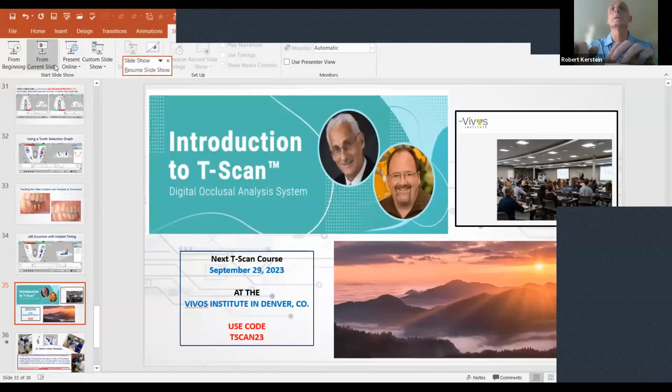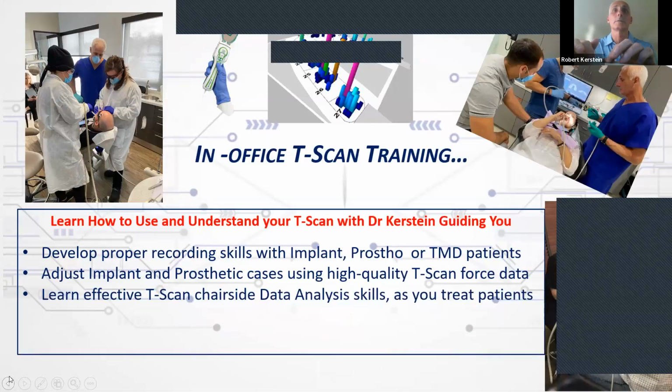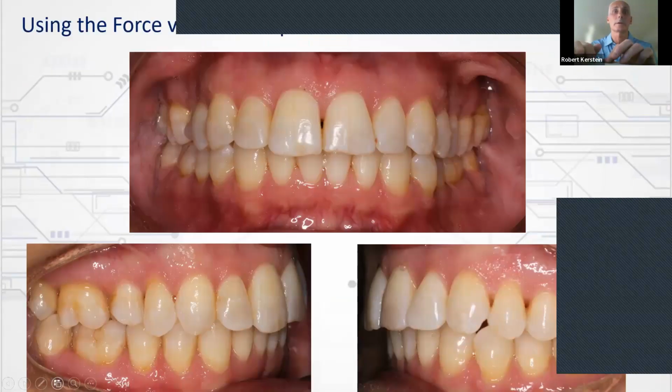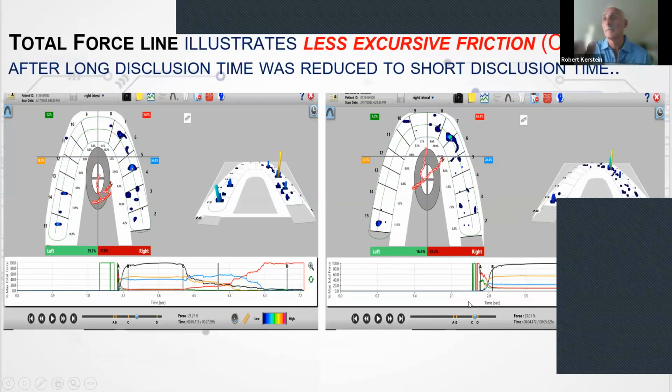Those two parameters, I can show that to you so it's more viable. I actually can show it in the PowerPoint because it's easier to do that. So let me find the slide, yeah, right here, this slide. Let's hit resume slideshow. Whoops, sorry, let me go back. Okay, it's coming here. Right here.